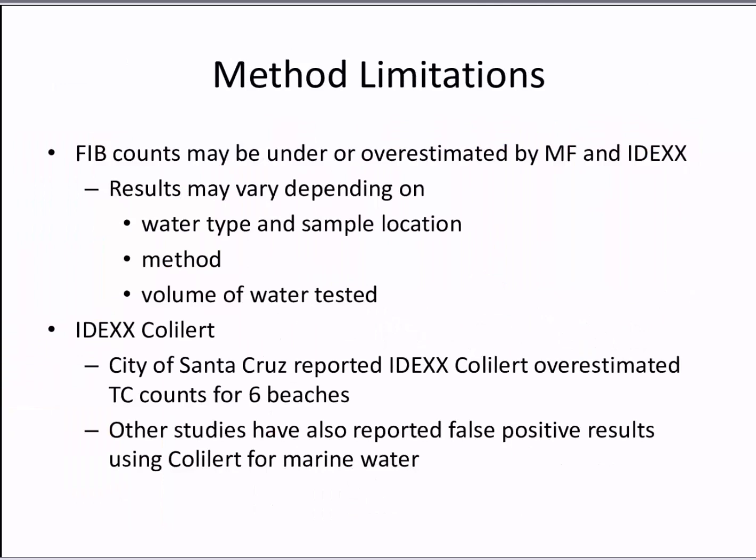Unfortunately, that's not something you can do using IDEXX. And I won't go into that in this talk, but it's very challenging. All right, so those are the two basic approaches for quantifying fecal indicator bacteria.